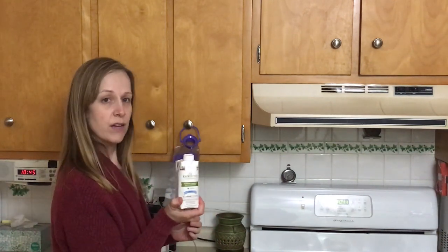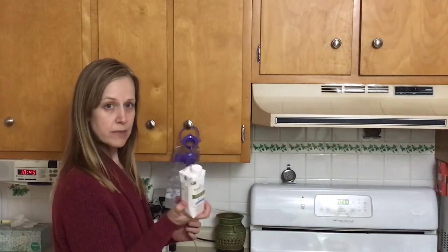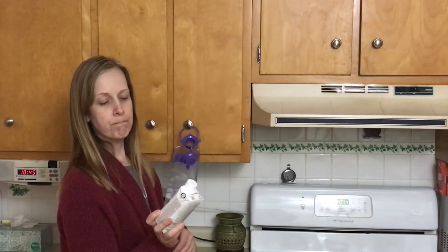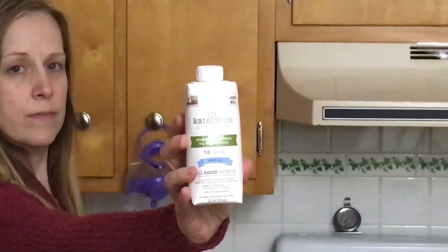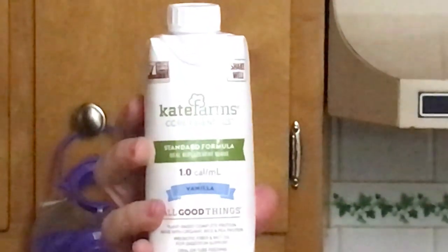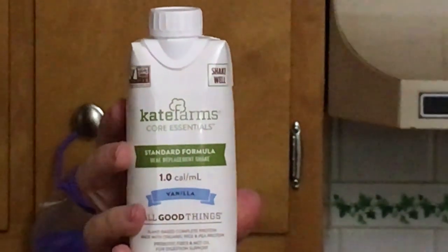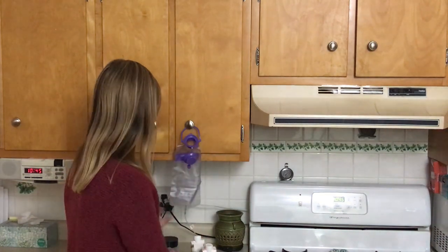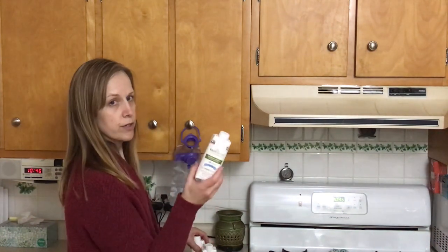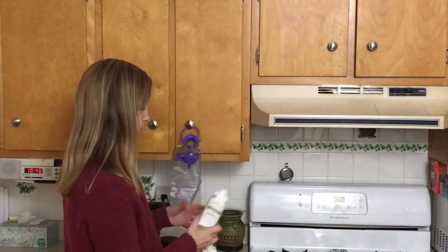She is on Kate Farms — it's the standard formula meal replacement shake. You can drink this orally too, but it's really great for using in the pump. She gets three of these cartons per night, and that equals her 975 calories and 975 milliliters.